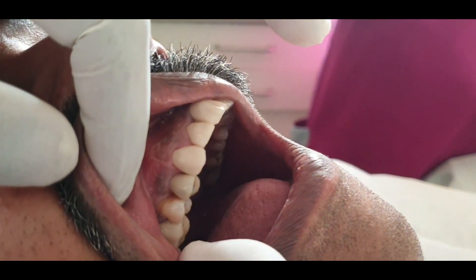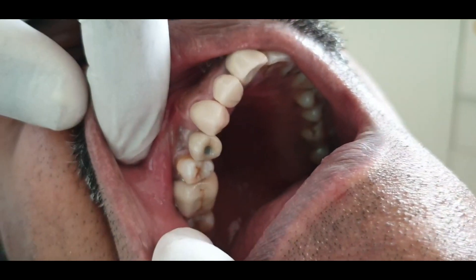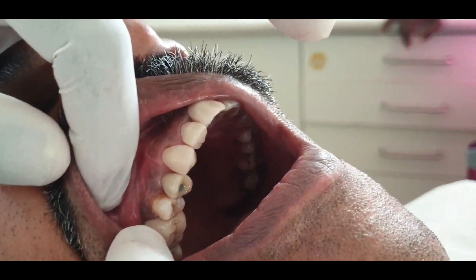If we use the crown, we get a natural look. If we adjust the gums, we can modify it. We will use the perfect restoration mode of the screw-retained crown.